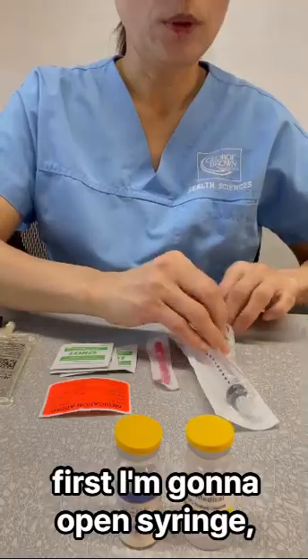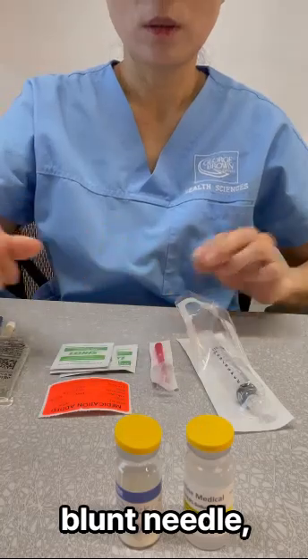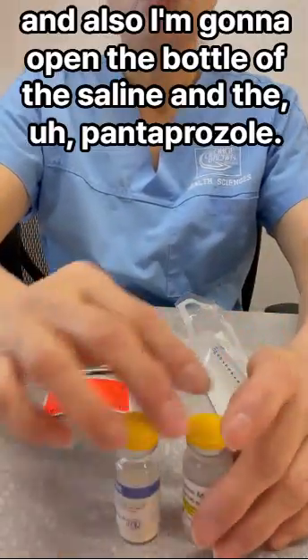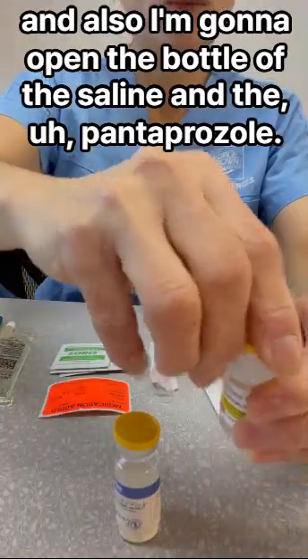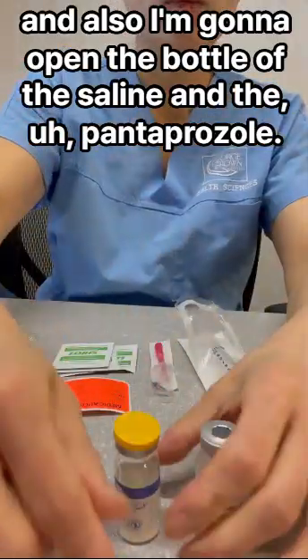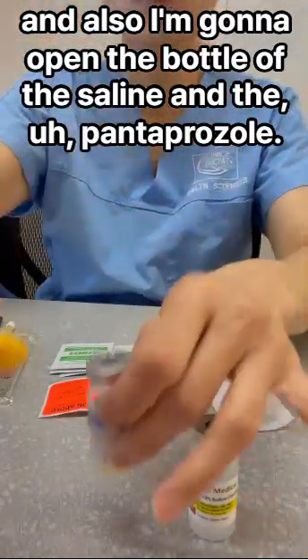First, I'm going to open the syringe, blunt needle, and also open the bottle of saline and the pantoprazole.